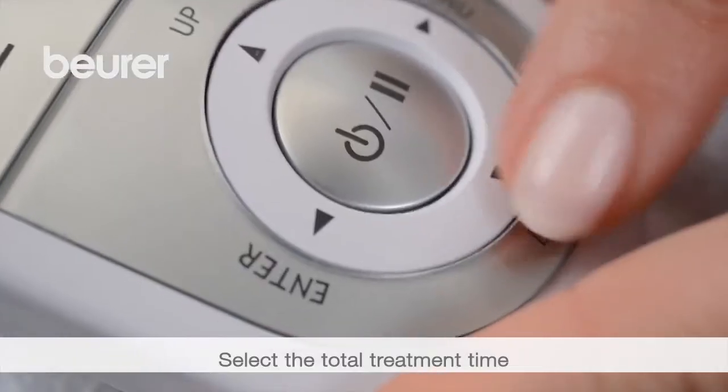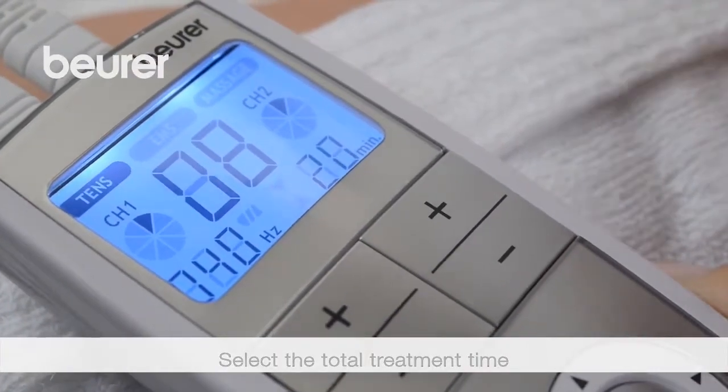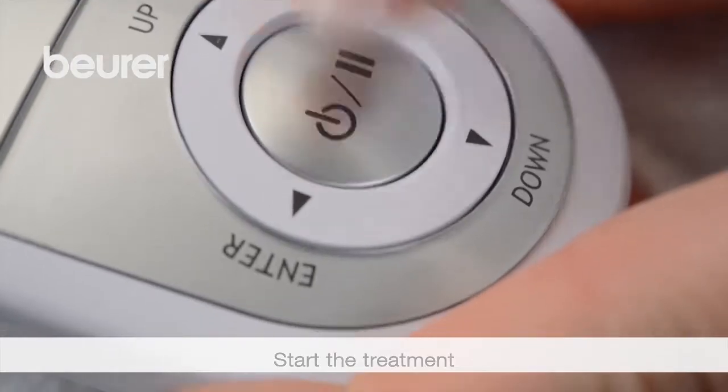Then select the total treatment time using Up-Down and confirm with Enter. Start the treatment with the On-Off button. You can also interrupt the treatment with On-Off.